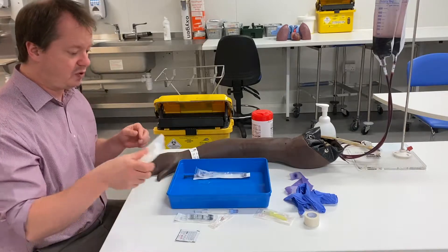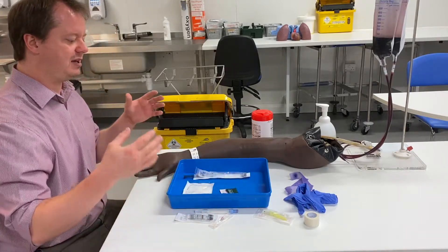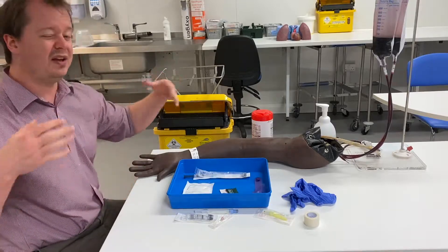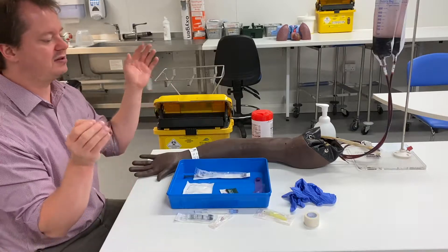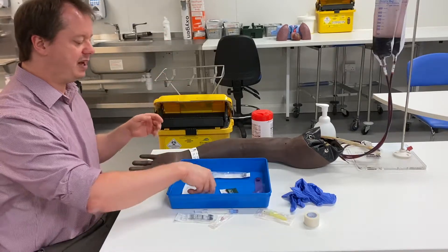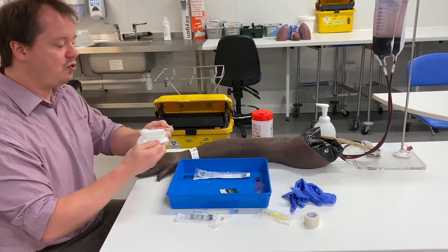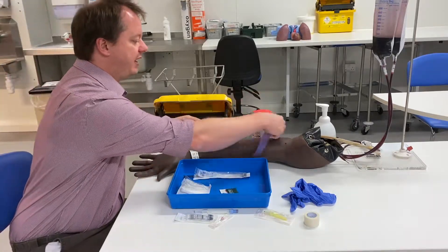We also want to get some gauze to cover up the hole we've made, a wipe to clean the skin with, a tourniquet, gloves, and a bit of tape. We're going to do all the things that we've done in all our previous videos: clean our hands, collect our equipment, clean the tray, put all our equipment out, and then go and see our patient, identify them using eCare as you would do normally, and put a tourniquet on and find the vein that you want.